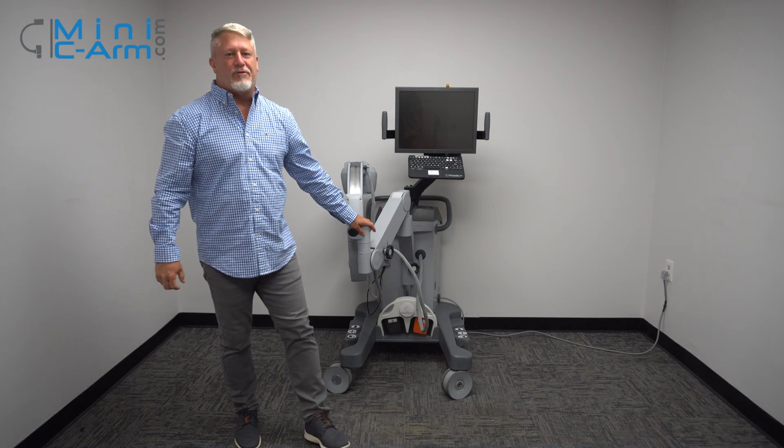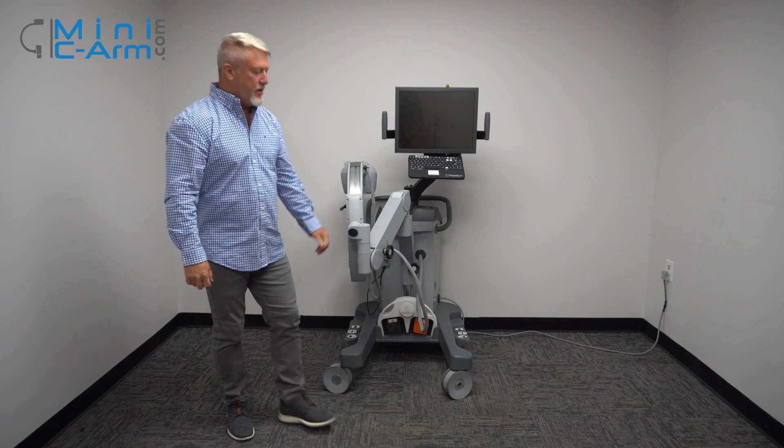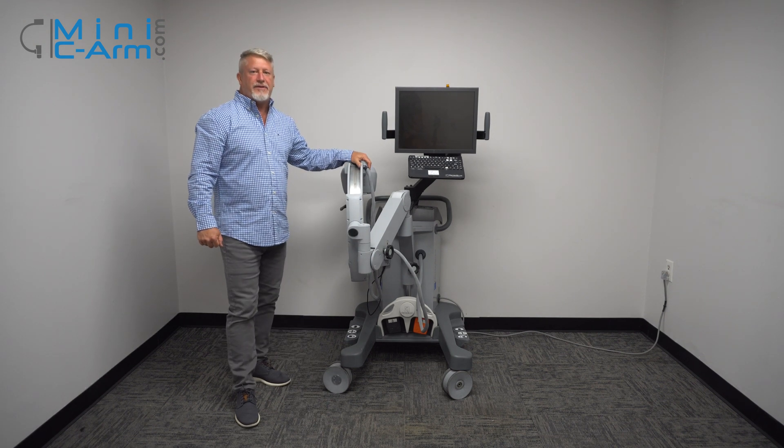Hey guys, I'm Christopher Bacon, the founder of OrthoScan and the president of MiniCArm.com. Today we're going to take a look at the OrthoScan FDOR.